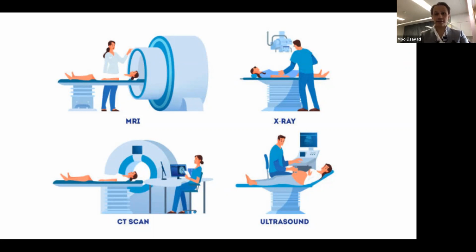It is safe, it is friendly. I really like this modality because it gives you quick answers in the right hands. And it also helps to relieve patient anxiety, having someone to talk to who could actually give them some advice. The top left is an MRI scanner.